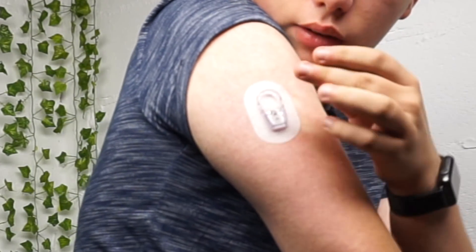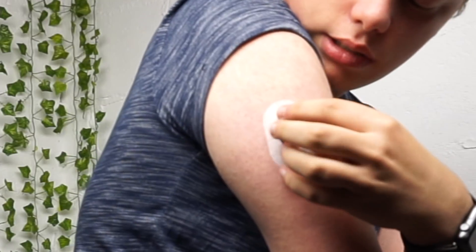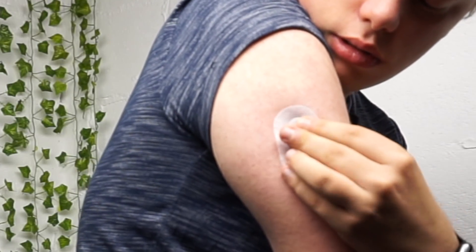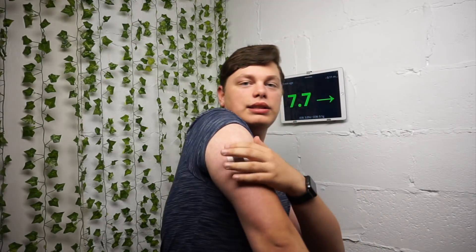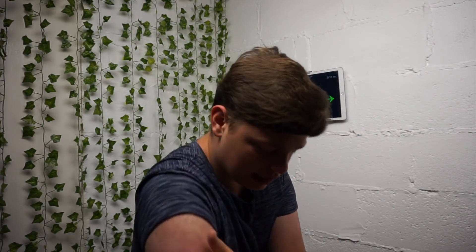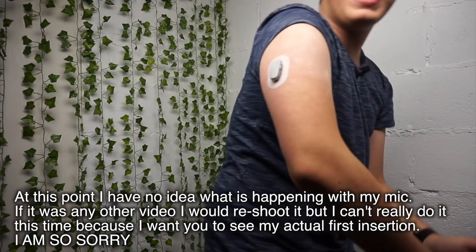I can't actually see where... okay, so you clip it in. There you go, that's it! Did you see that? I hope you saw that because the light is here. Oh my god, I'm on Dexcom! I'm so excited!